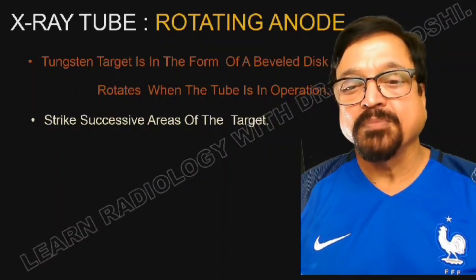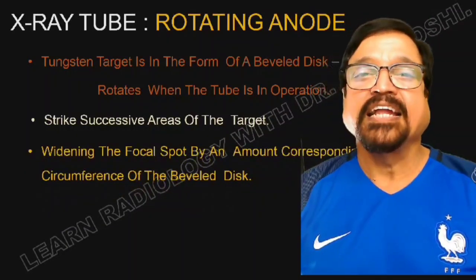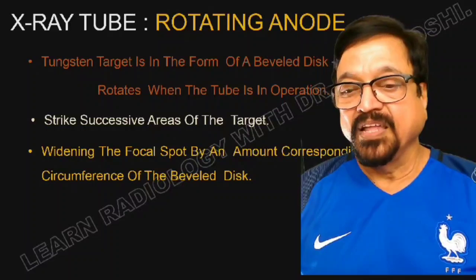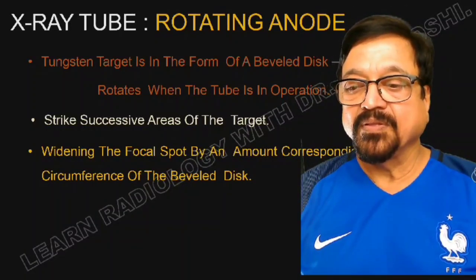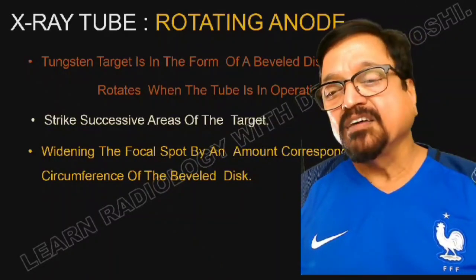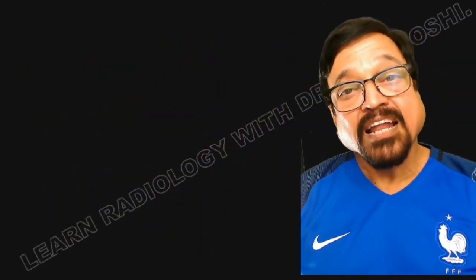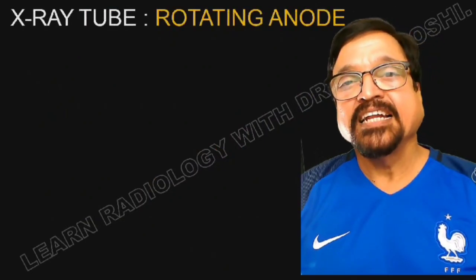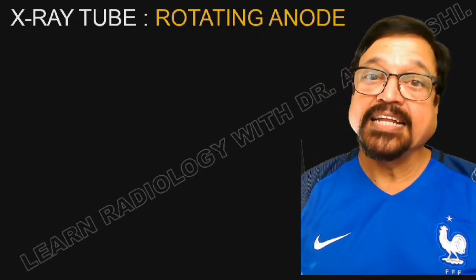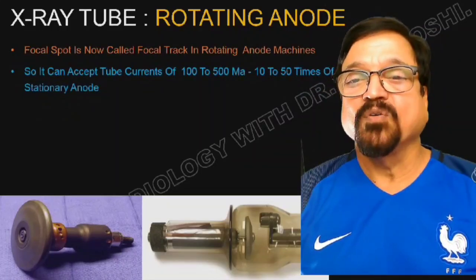It rotates when the tube is operating at a speed of 3600 rpm, rotations per minute. Then it strikes successive areas of the target. So every time a different area of the target is hit by the electrons. Why? Because the anode is moving. Now there is widening of the focal spot by an amount corresponding to the circumference of the bevel disc. Distribution of the heat over this extended area further helps to make it more efficient. That can result in being able to take heavy exposures, give exposure for a longer time, and secondly take exposures at a successive rate, like you need for angiographies.